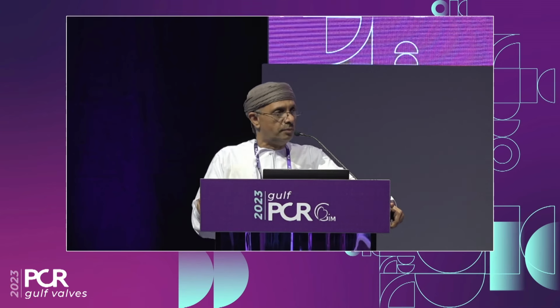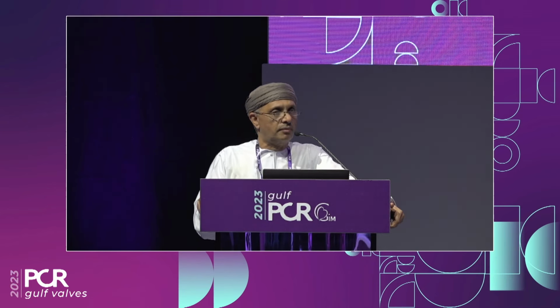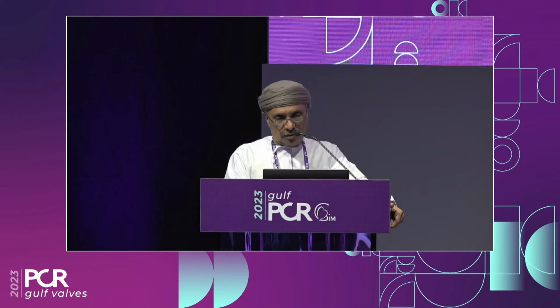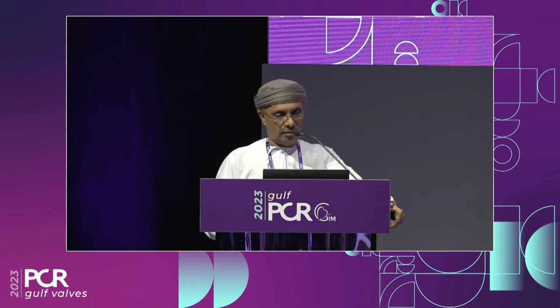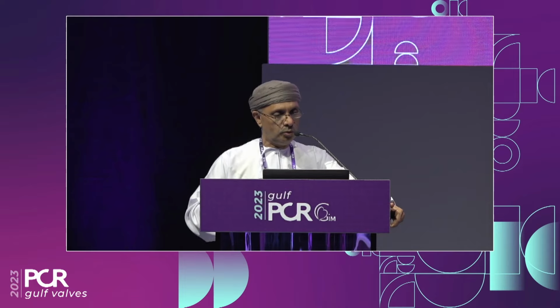And we didn't even use the back wire. We just used the Confida wire, and the valve went nicely. So I'll continue with the video. So we pre-dilated with 22 balloon.